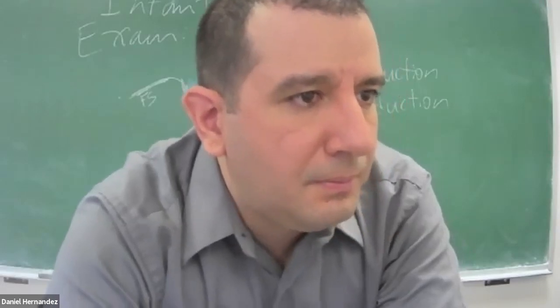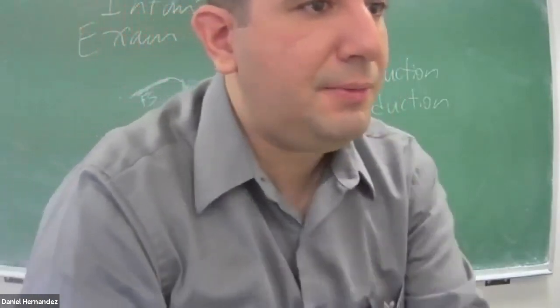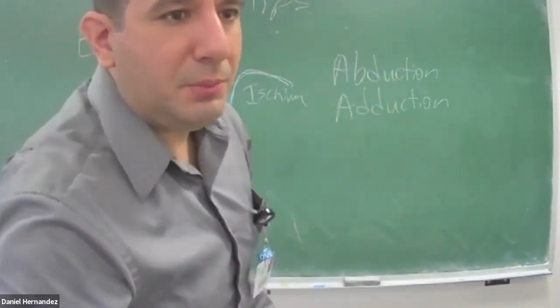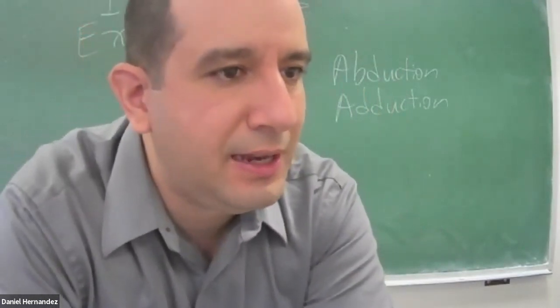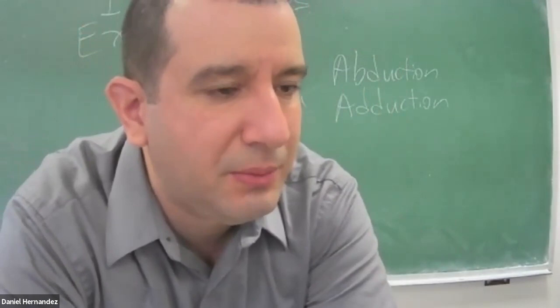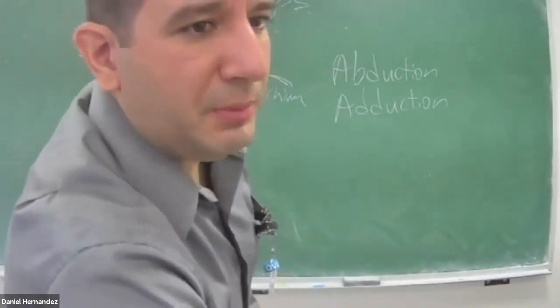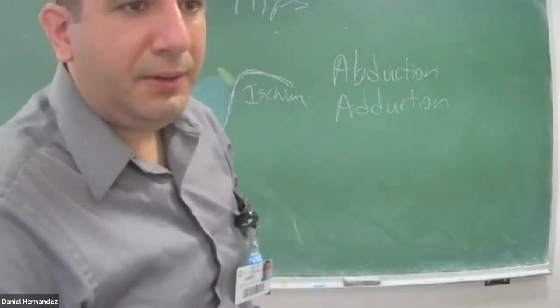Just want to show you this, guys. So, treatment and sonographic follow-up. The most important factor influencing the outcome of DDH is the age at which diagnosis is made and treatment is initiated. Treatment should begin before the patient walks, and ideally long beforehand.